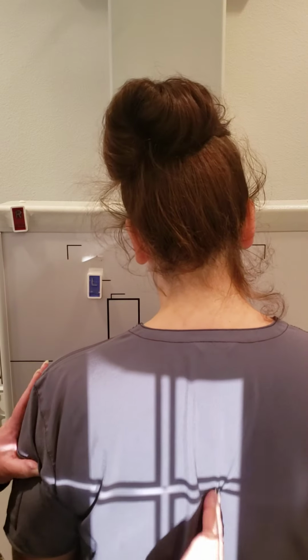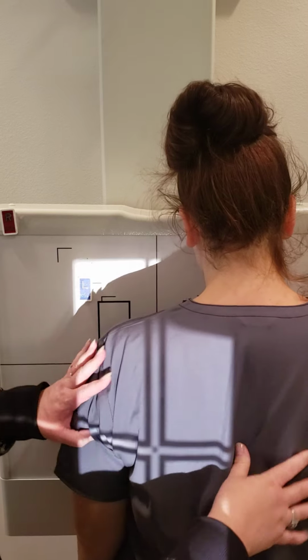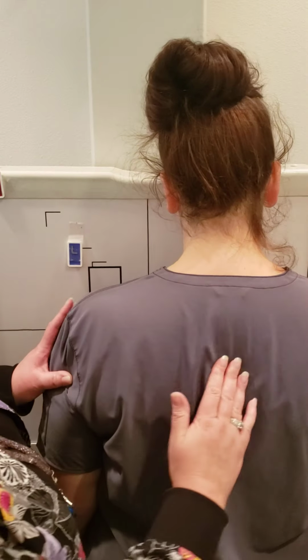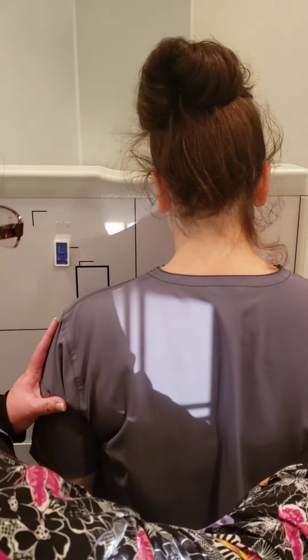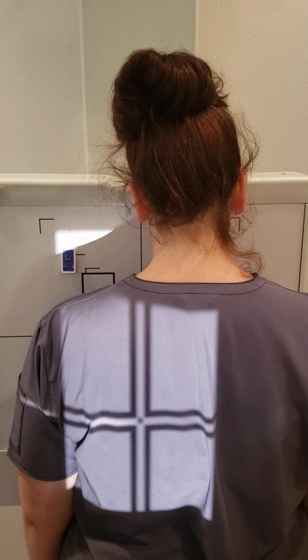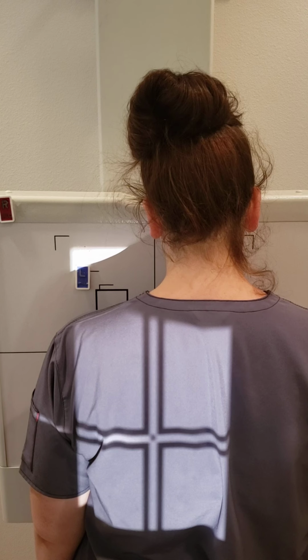And we're going to focus again on unilateral, but just the one side. So all the way up against the board. We're still at T7. Just going to bring her over here. Again, we want to make sure that we get collimation over, so just a little bit more to your left. There you go. I've got my shield behind me. So this would be to visualize the left anterior ribs.